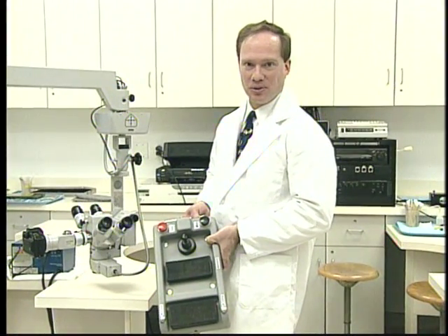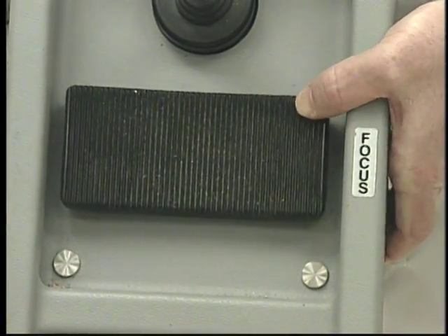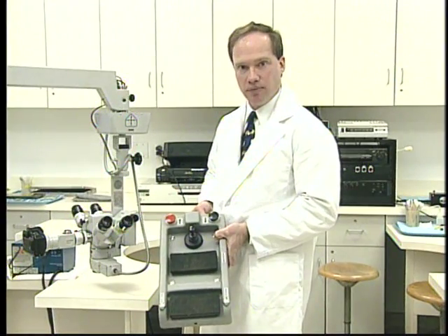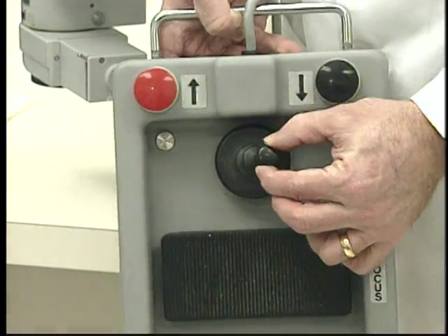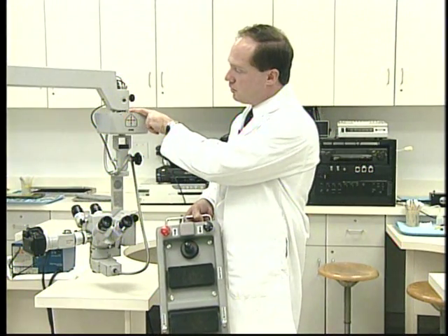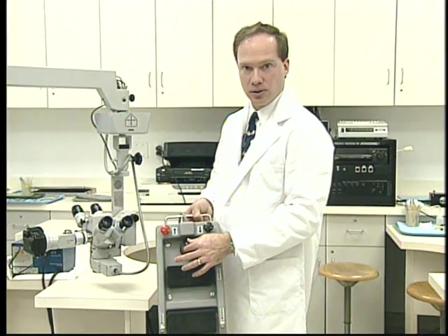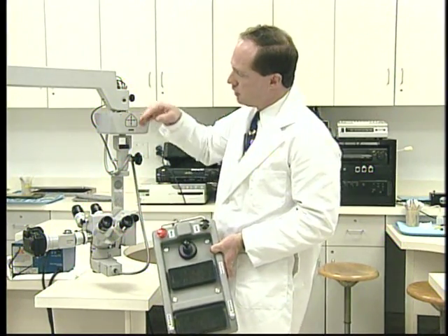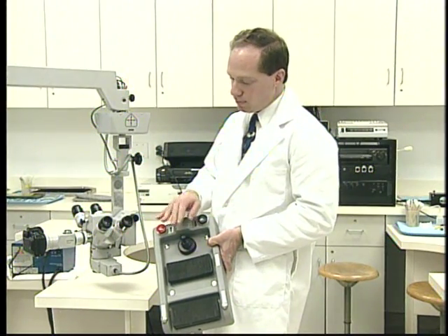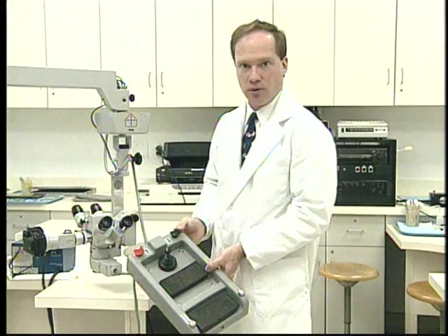Now let's look at the foot pedal controls for the operating microscope. While different models will have different controls, usually there's one pedal to adjust the fine focus and one pedal to adjust the zoom, that is, zoom in and zoom out. Also, scopes will frequently have an XY attachment. This is a joystick that will control the motion of the microscope in millimeters, one way or the other. It's important that this be synchronized with the control on the microscope. When you press the button on the top, this will centralize it, and from then on in, movement of this joystick will cause the scope to move in fine increments. If this is turned the opposite way, when you move the joystick, the microscope will move in exactly the opposite direction from the direction you intended to go. So it's important that this be facing you like this on the floor, and then when you move the joystick, the microscope will move in the appropriate direction.